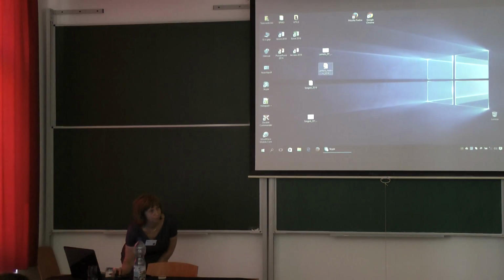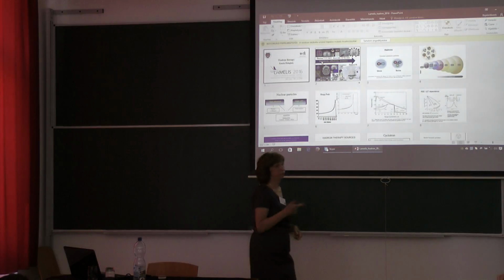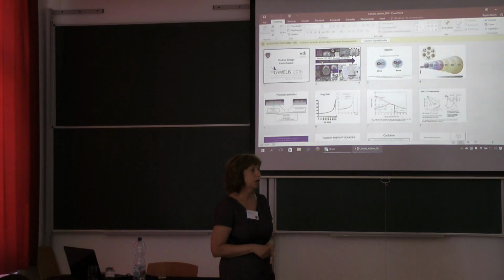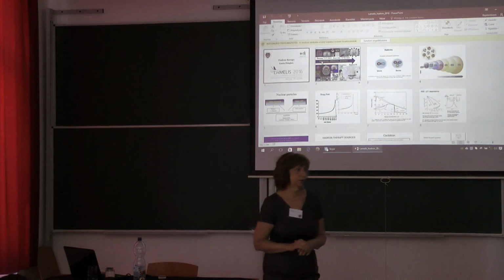Hemorrhoids are one of those high uptake without being, I don't know, cancerous? No, it's rather highly functioning areas, but sometimes there is some inflammation. It is very typical, for example, that a tumor can be surrounded with inflammatory reaction, and it causes higher metabolic activity, higher glucose metabolic activity, and it should be separated from the tumor tissue.